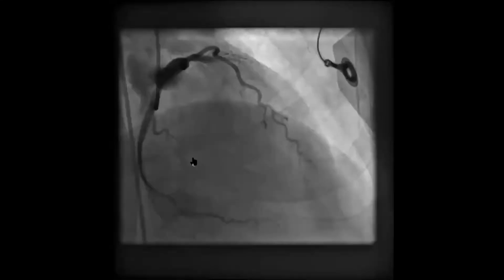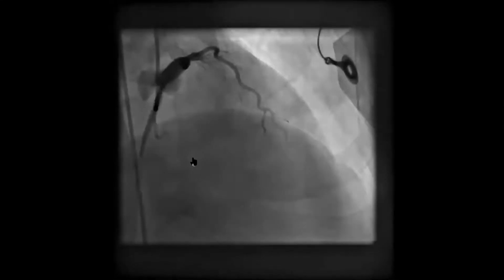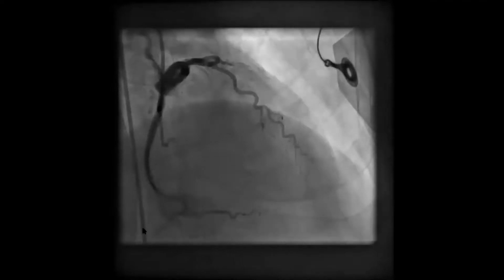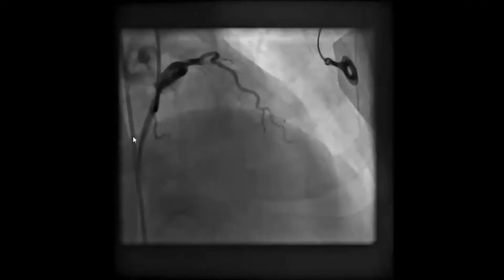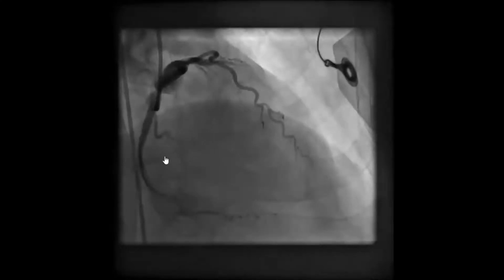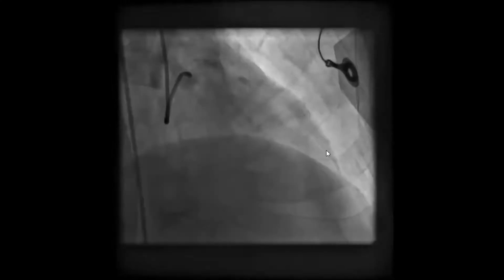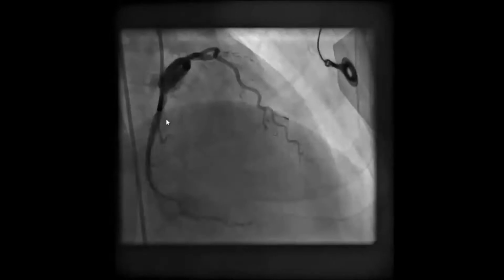Right. Now, again, looking at these vessels, what do you think this view is? You look at this, and this is a left system, and this is a femoral procedure because you can see the catheter going up here, and you see the injection circumflex going this way. You know it's a cranial view because the diaphragm is occupying more than half of the screen.